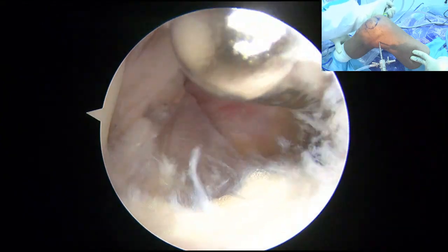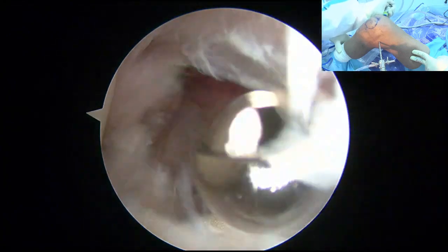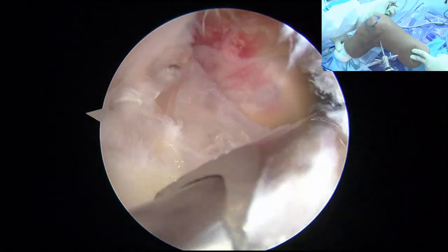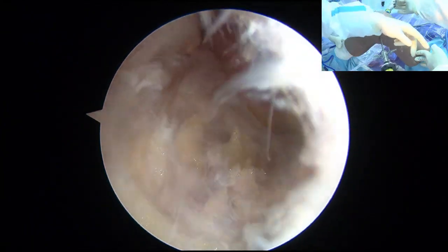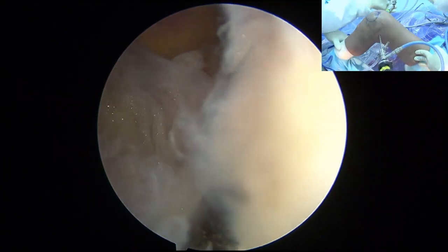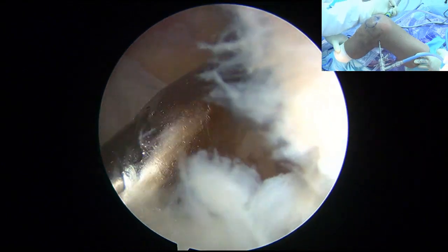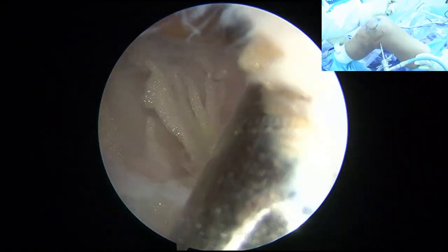Soft tissue clearing. Okay. Here, you can move the soft tissues here. This is the septum, right? If you stay in this line yourself, and then you go to the center. Okay, hold this. Then enter the midline. Okay, good. And then we slowly clean this. Okay, so we clean in until we see the tibia.